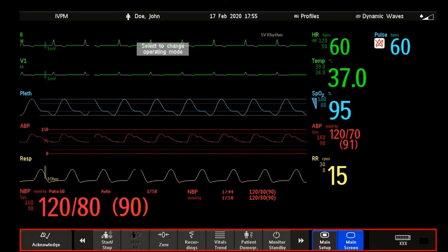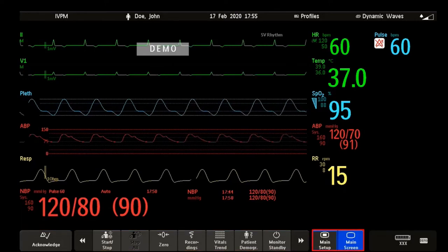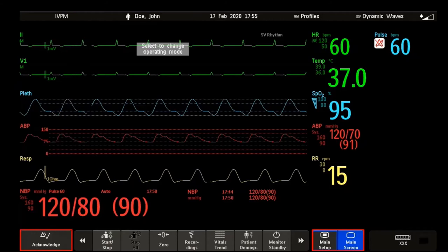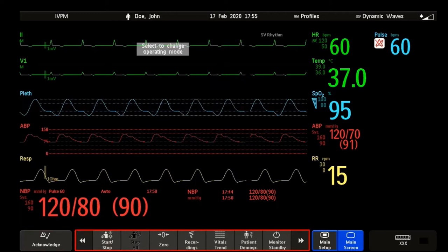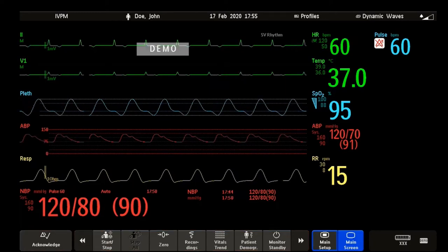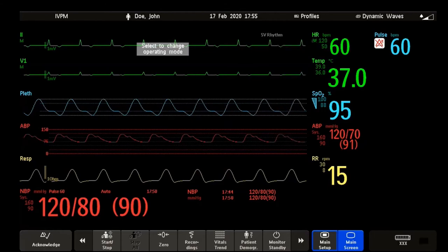These are the screen keys. Some keys are permanent keys like the main screen key, the main setup key, or the acknowledge key, and others are smart keys. Smart keys give you fast access to functions. You may also find some hard keys as physical keys on your monitor device — for example, to start or to stop a non-invasive blood pressure measurement.